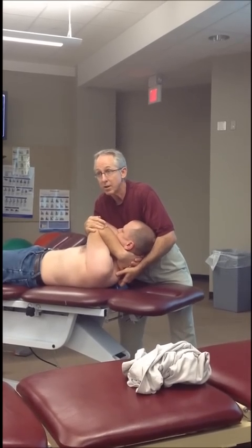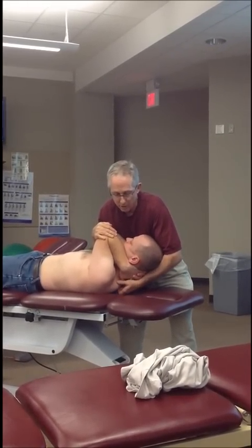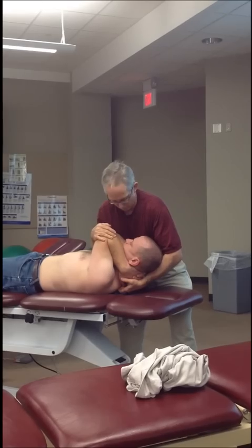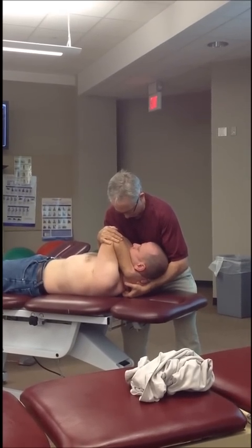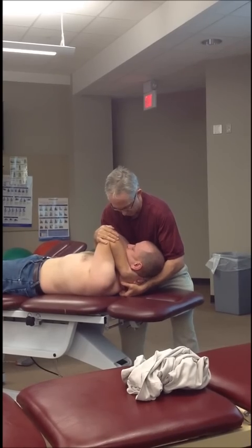It's unnecessary. So I'm going to let his body weight drop on top of there, and as soon as his weight arrives onto the post of the wedge, I'm where I need to be. What I would like you to do, he's a well-educated patient, is tuck your chin away from me, do a dorsal glide, please. Yeah, but I don't want cervical flexion, which is what you did.